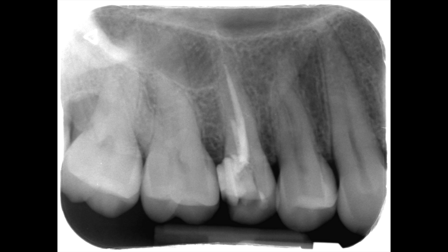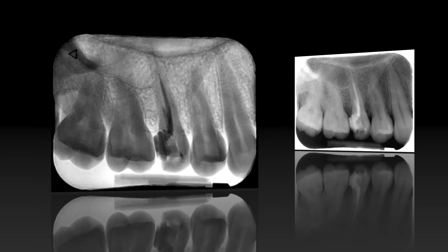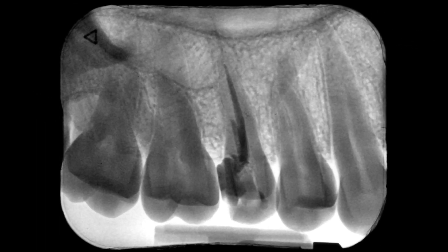Here you can see the pre-operative radiograph. The technical quality of the previous root treatment is poor. There are at least two root canals but both of them haven't been instrumented and obturated. An inverted image gives another impression of the existing root canal treatment.